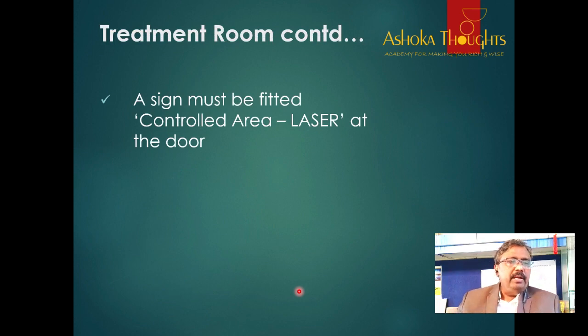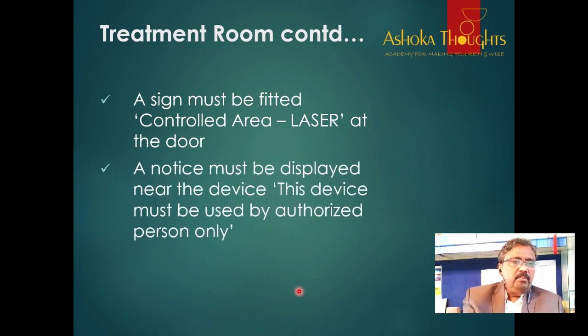A controlled area laser sign must be fitted outside of the laser room. A notice must be displayed near the device: this device must be used by authorized persons only. That message must be there.